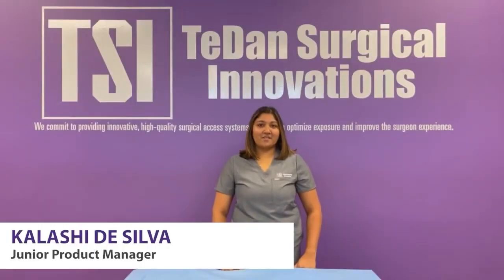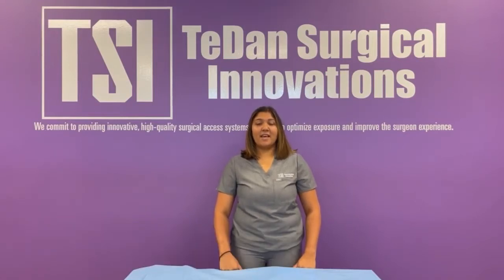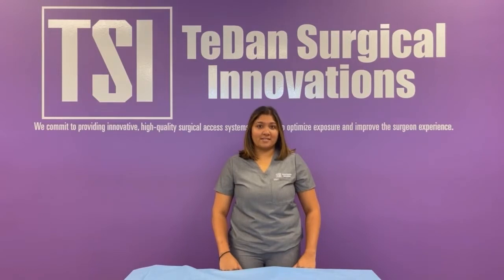Hi, my name is Kalashi De Silva and I am a Junior Product Manager at TeDan Surgical Innovations. Today I will be walking you through a few tips and tricks to properly maintain your Phantom AL Anterior Lumbar Surgical Access System. If you would like more information on this system, you can visit our website or YouTube channel for video tutorials on the setup and overview.